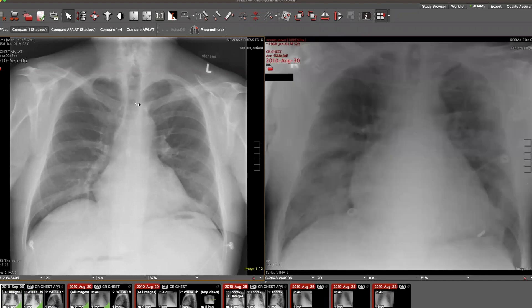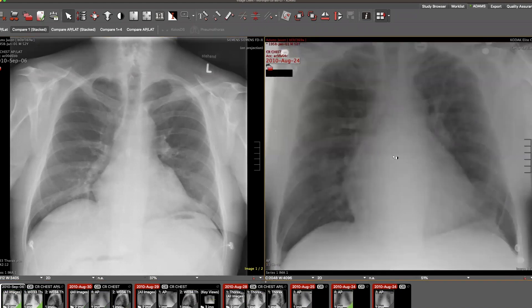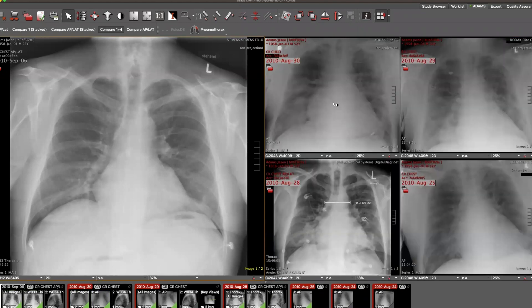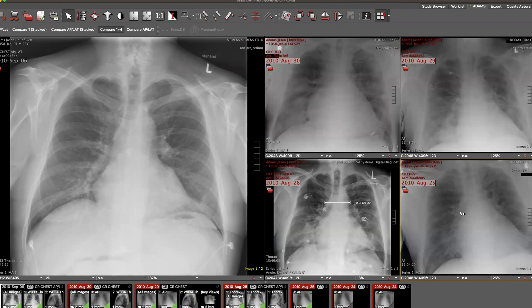If I step to a different layout, I can display the current study on the left, and going back in time, stacked, rolling my mouse wheel, I can display all of the priors. One additional option here is the current study on the left, the most recent prior in the upper left corner of the right display, going back to the most historical.